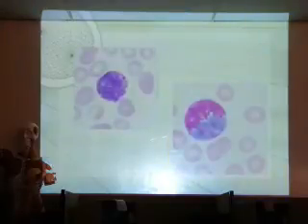Okay, just a couple of other examples, actually they're both basophils. The one on the left is more obvious. You have dark inclusions in the cytoplasm, but this one is not as filled with inclusions, so you can actually see the purple nuclei inside. It's a bilobed nucleus. It's a single nucleus, but it's separated into 2 lobes. So it's still one nucleus cell.